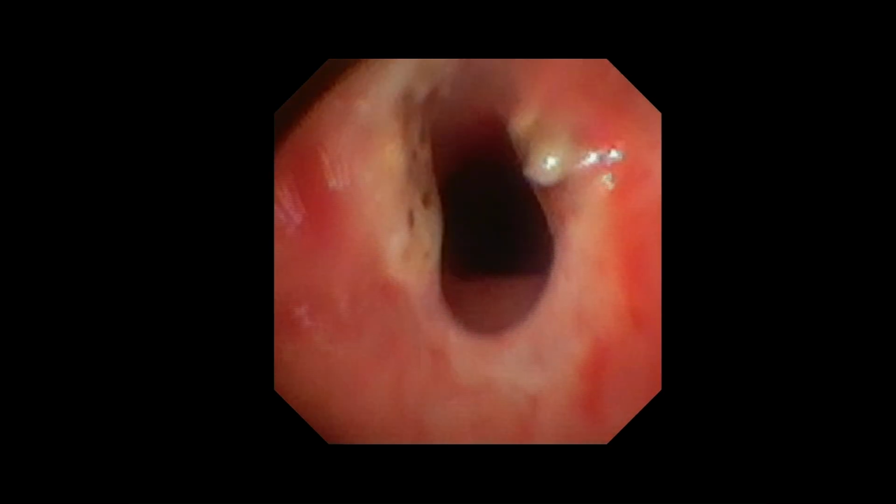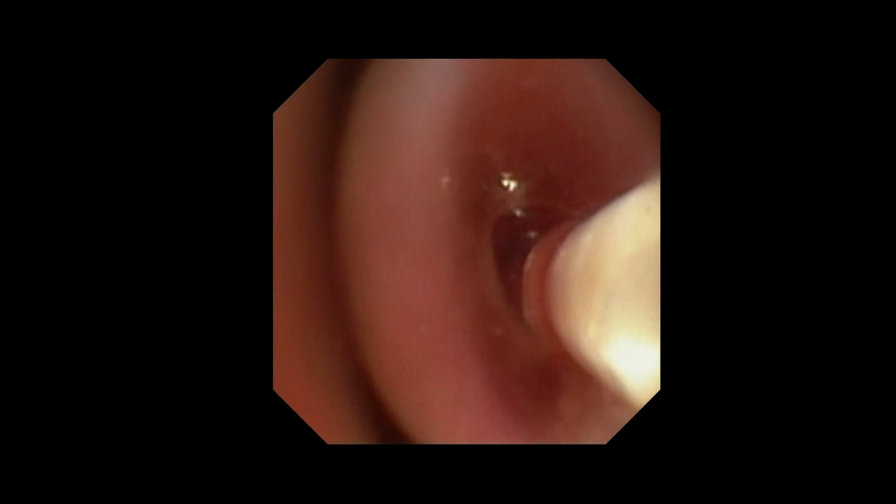And that's the left main. That's the right main and the left main. So the whole area beyond the stenosis remains normal, except the subglottic space where you have the fibrotic bridge causing airway narrowing.